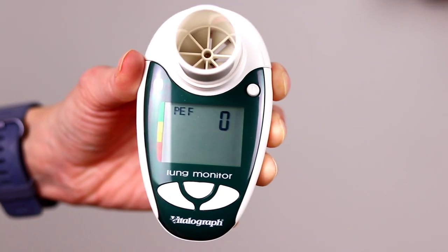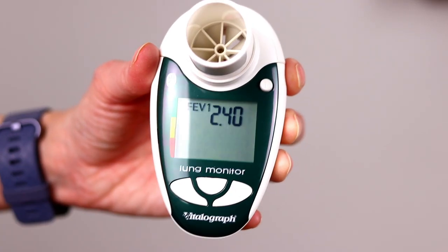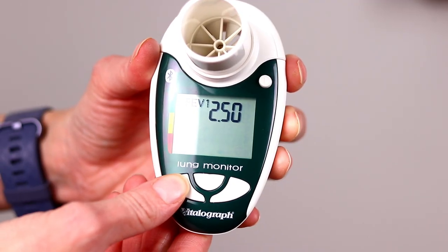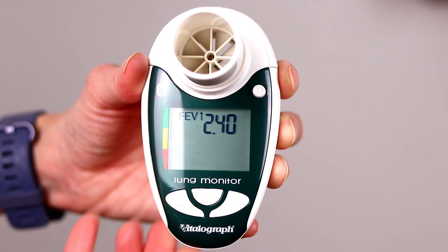If your clinic has given you the FEV1 personal best to set up, you can do this by simply pressing and holding down the up and down arrows at the same time. You will hear a beep and the screen will change to PEF0, and then if you press the middle button or the return arrow you can change this to FEV1. Using the up and down arrows you can enter the value given to you by your CF team, and once you're done press the return button to save it.